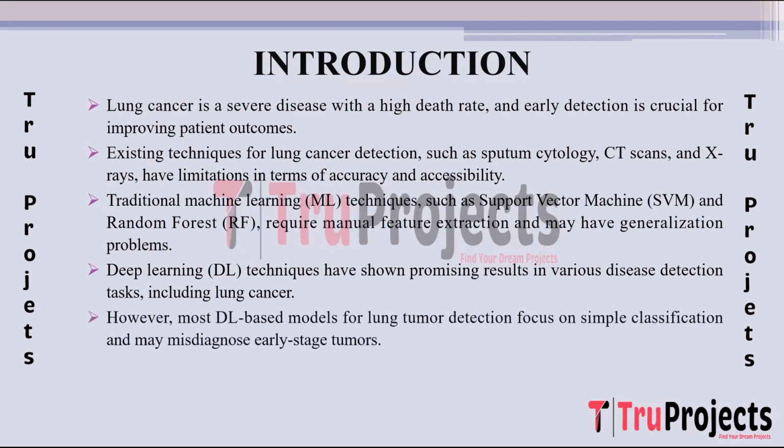While deep learning models have shown potential, many existing models primarily focus on simple classification tasks and might not be adept at accurately identifying early-stage tumors. Early-stage tumors can be tiny and harder to detect, leading to potential misdiagnosis or oversight.